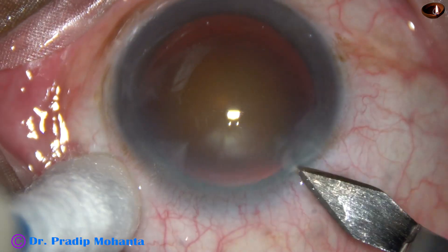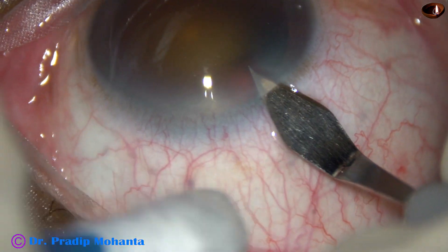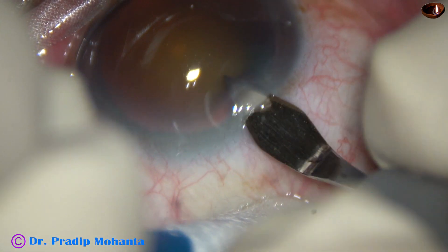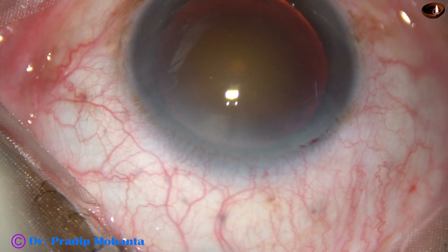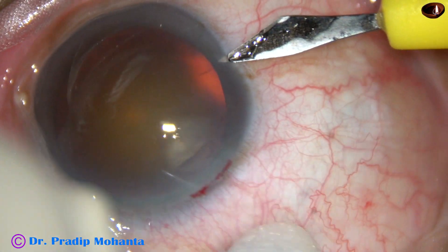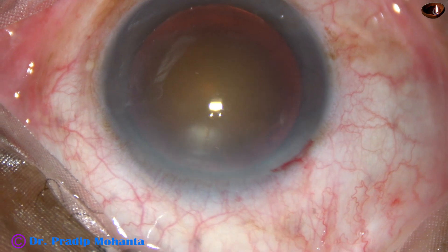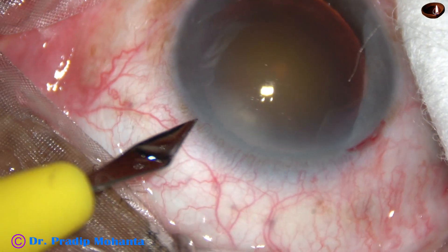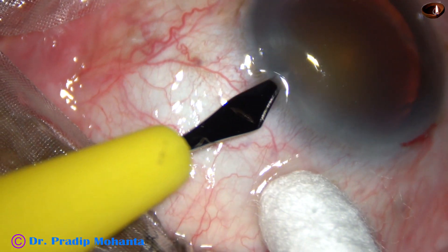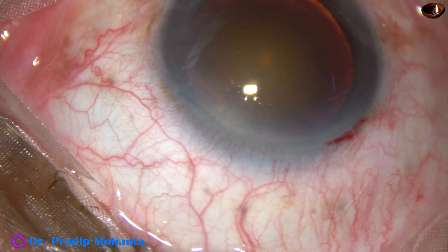This is the main incision with a 2.8 mm steel keratome at around 11 o'clock. A side port is being made on the right side of the main incision about 3 o'clock hours away, and another side port is made on the left side of the main incision about 2.5 o'clock hours away.